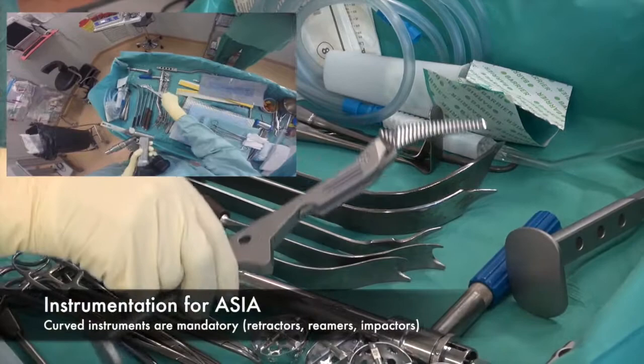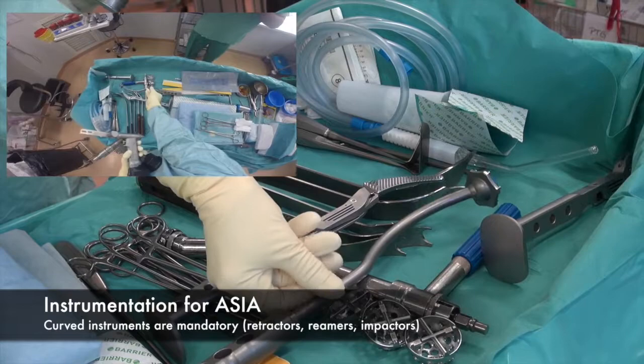1. Curved instruments are mandatory. Retractors, reamers, impactors.